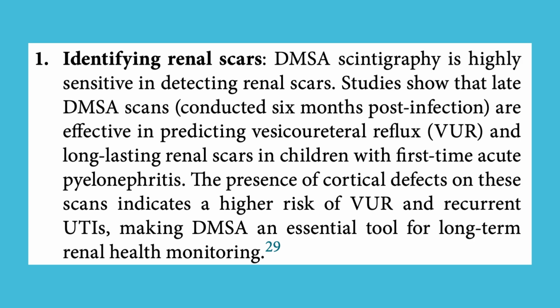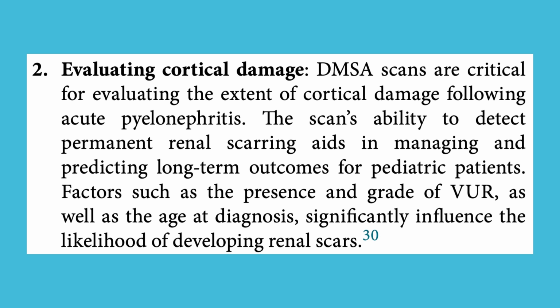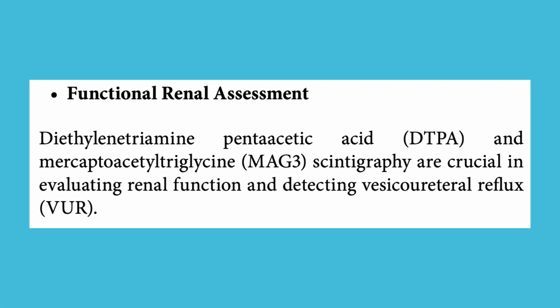The presence of cortical defects on these scans indicates a higher risk of VUR and recurrent UTIs, making DMSA an essential tool for long-term renal health monitoring. 2. Evaluating cortical damage. DMSA scans are critical for evaluating the extent of cortical damage following acute pyelonephritis. The scan's ability to detect permanent renal scarring aids in managing and predicting long-term outcomes for pediatric patients. Factors such as the presence and grade of VUR, as well as the age at diagnosis, significantly influence the likelihood of developing renal scars.